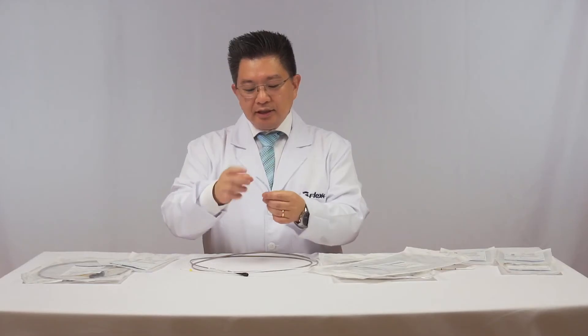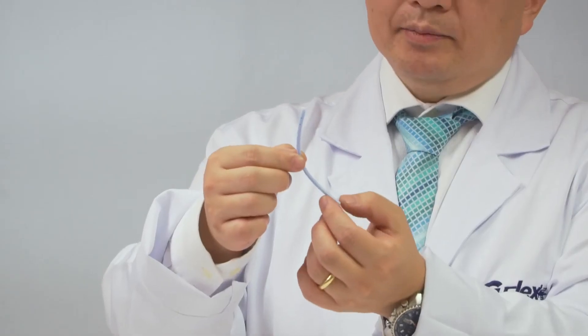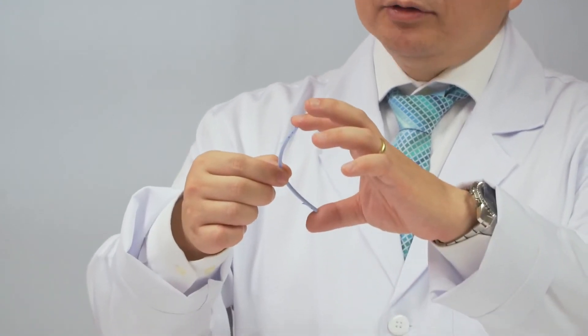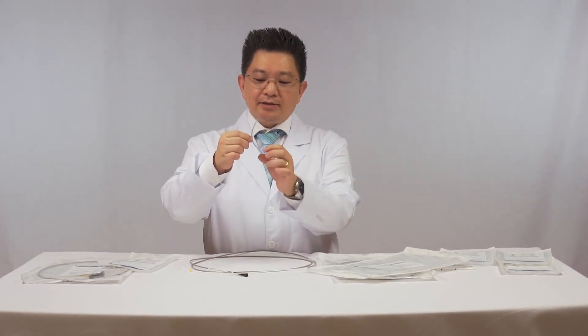The shape of this stent is like a boomerang — it has a central angle. It's very useful because the stent remains anchored in three points inside the biliary tract.